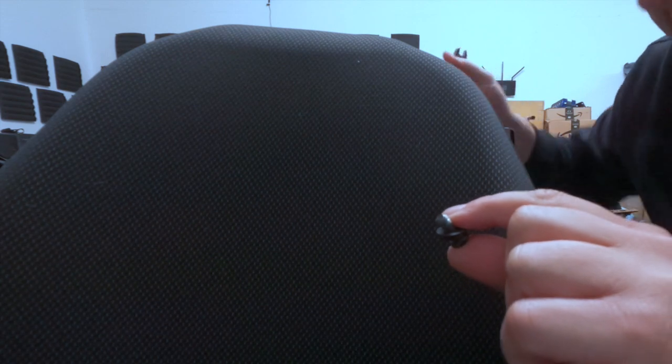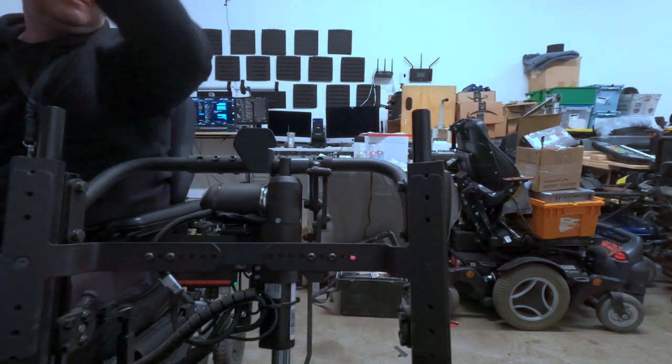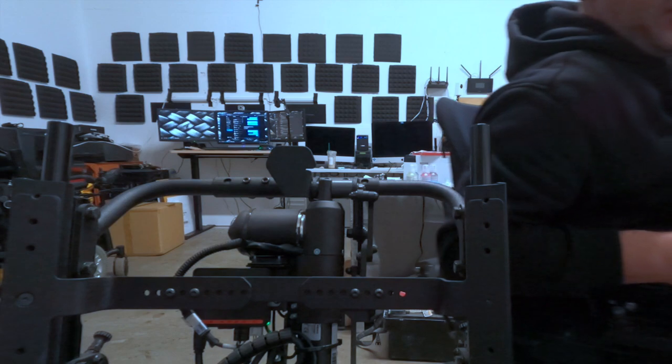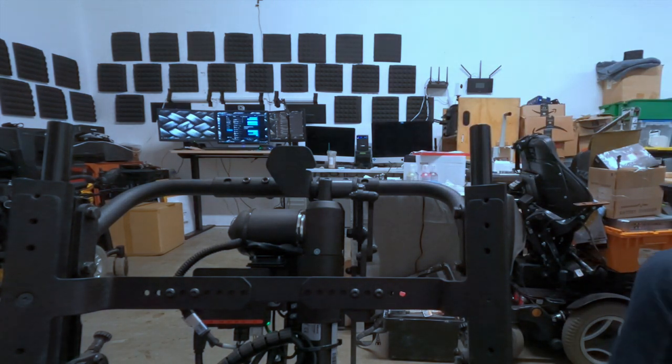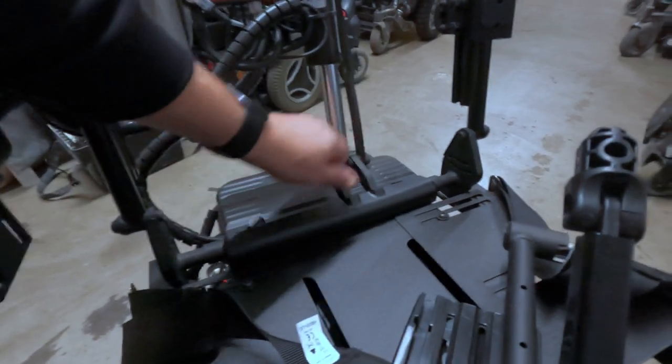Engaging sunshine mode — yeah, there we go. I think it's going to work, it's wiggly now. These do have quite a stack of hardware with the washer and lock washer, so I don't want to lose that. And there we go — comes right off. I really need to build some workbenches or something in here; I just don't have enough flat surfaces to put things on.